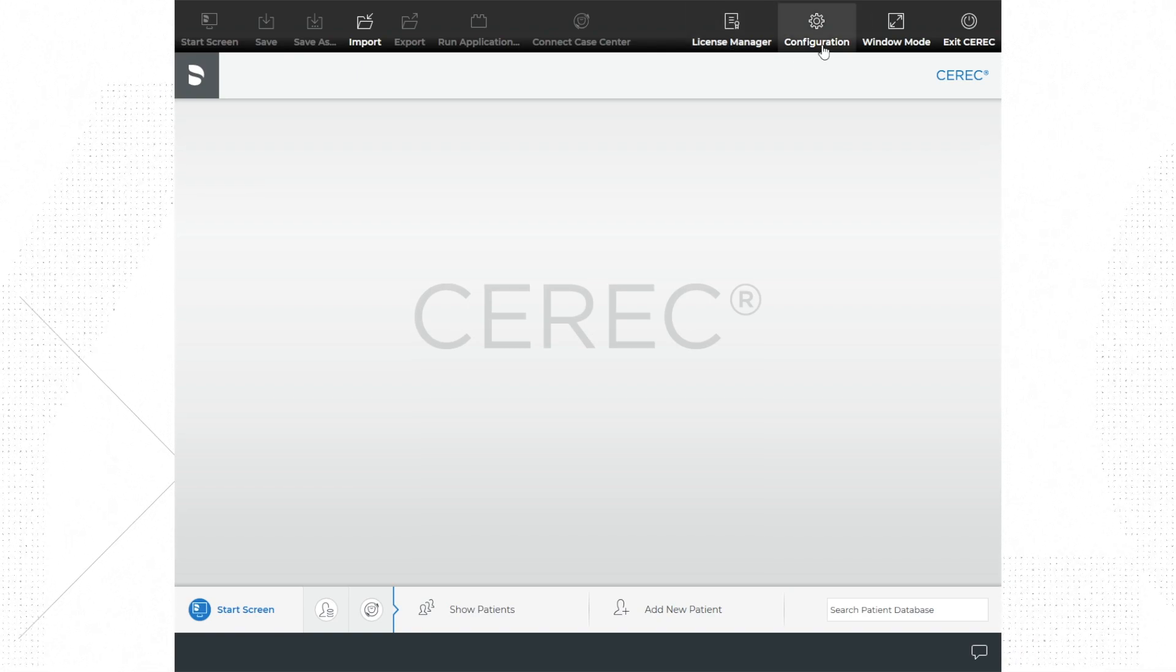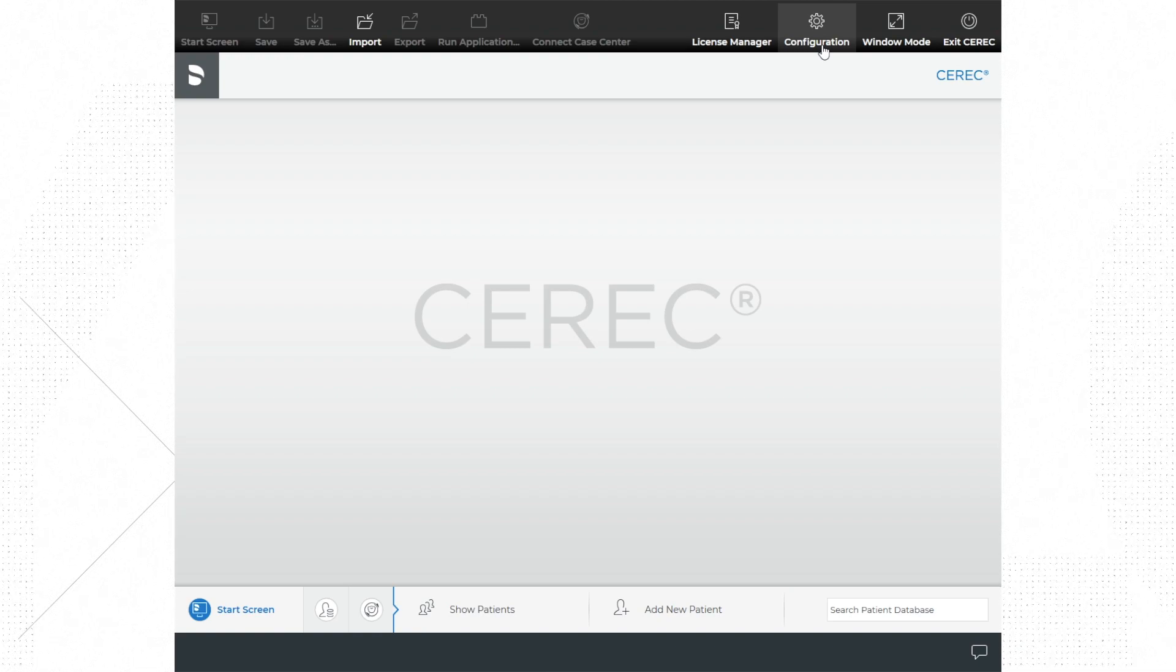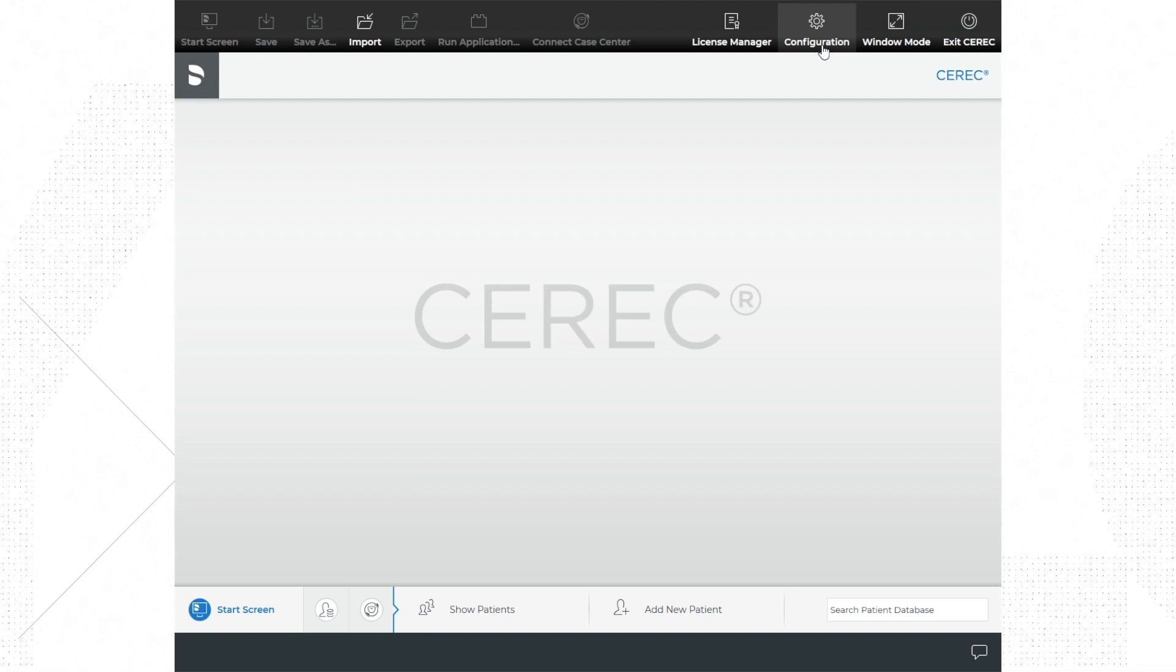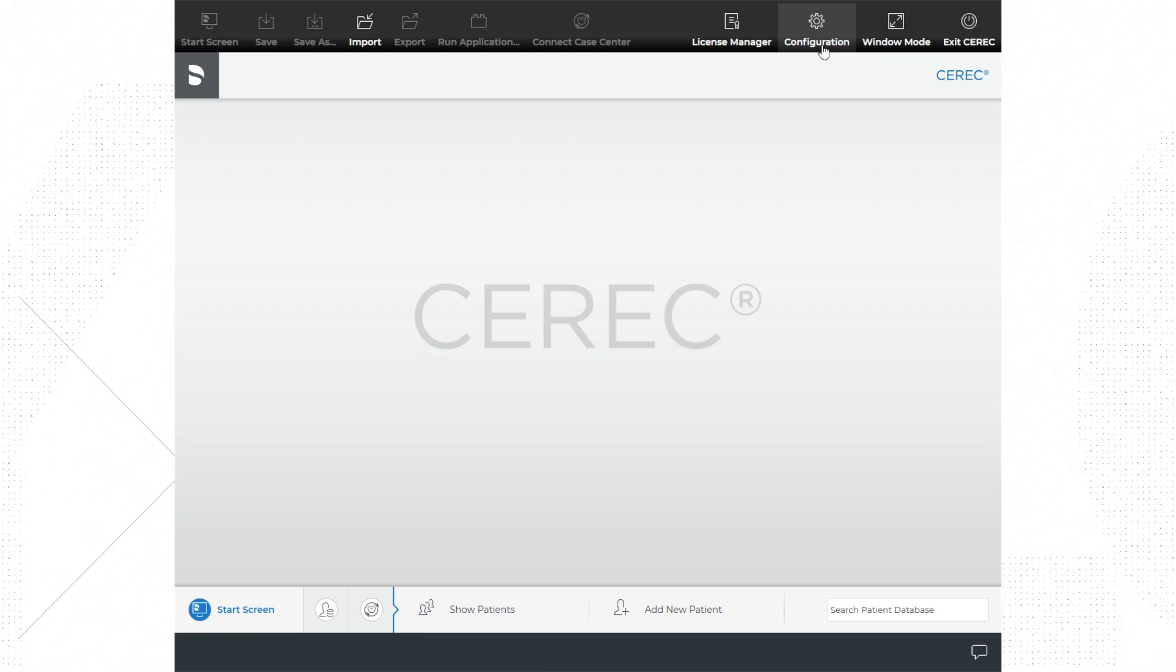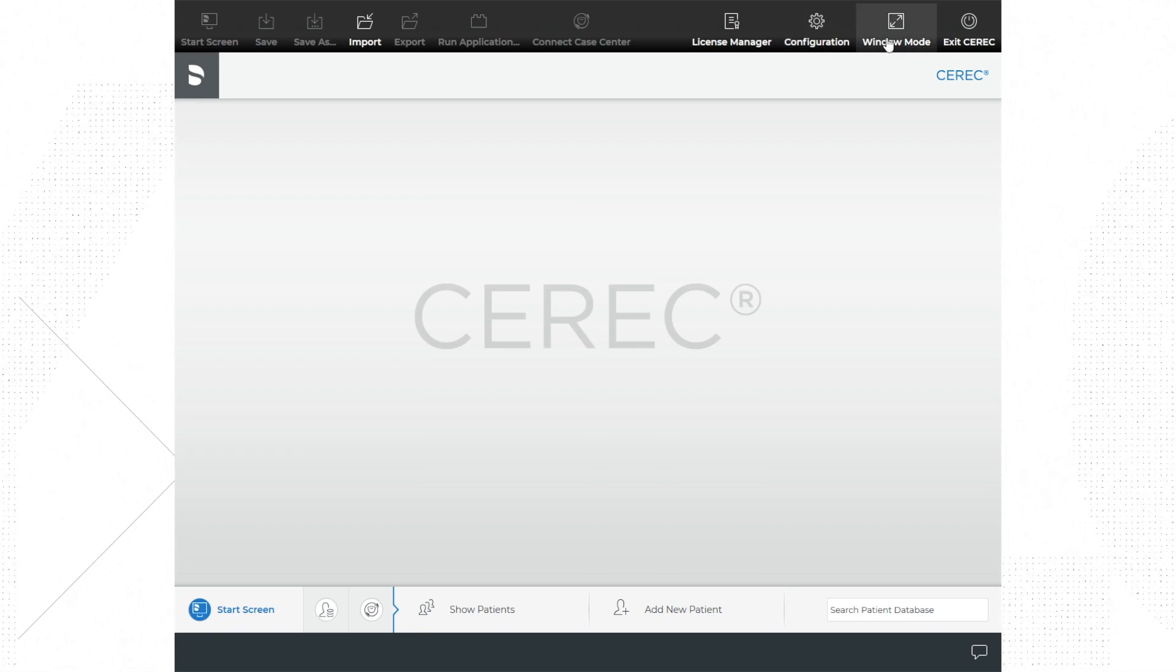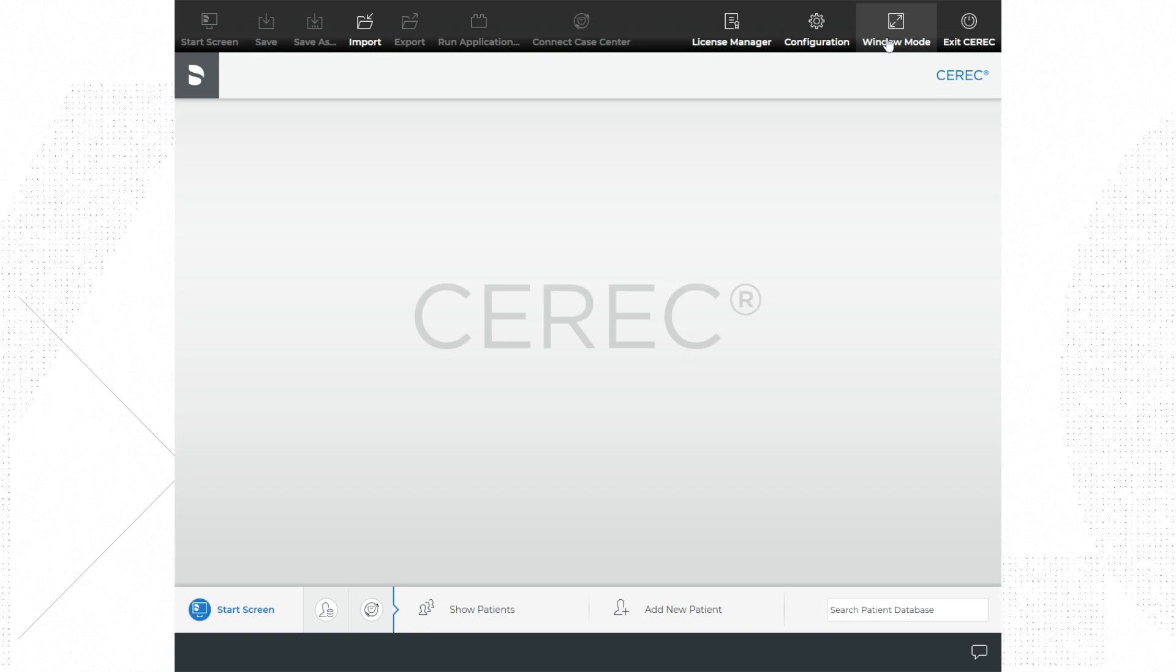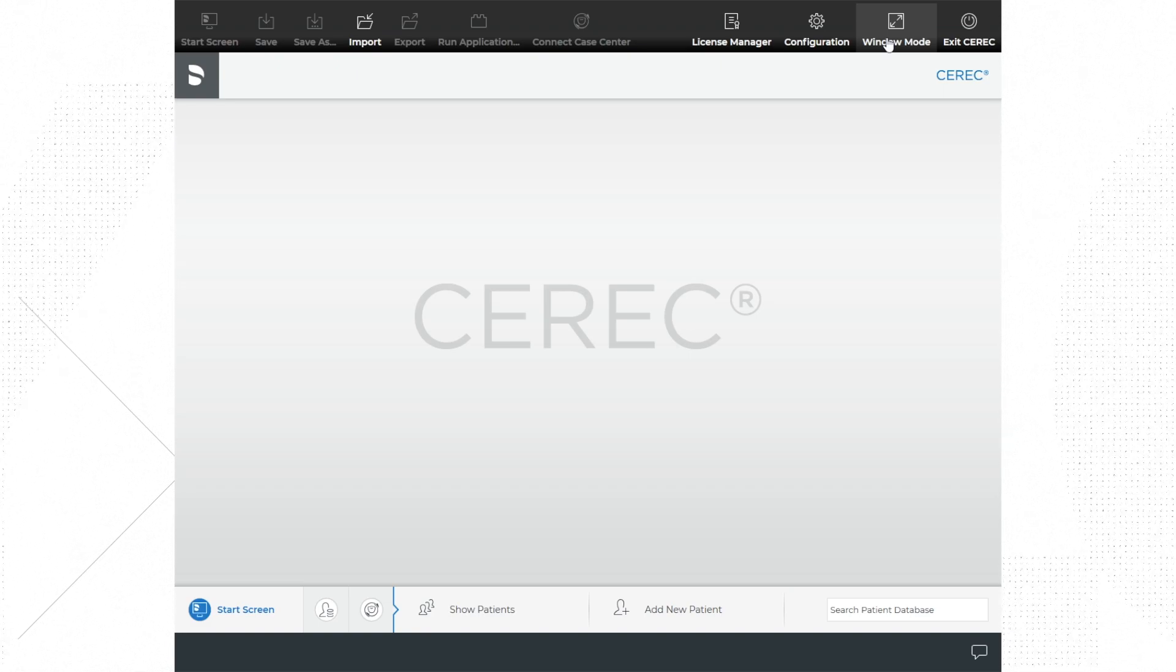Windows mode allows you to minimize the CEREC software screen and navigate other features on the computer's desktop. This can come in handy if you have multiple providers sharing the CEREC machine at the same time.